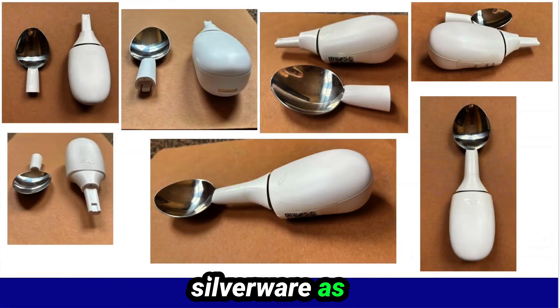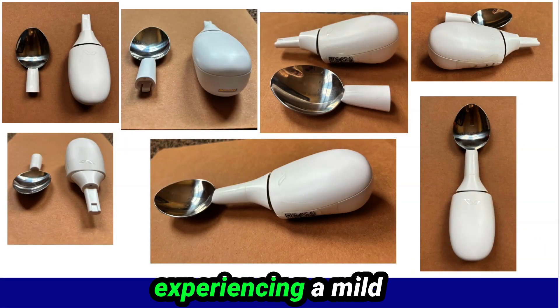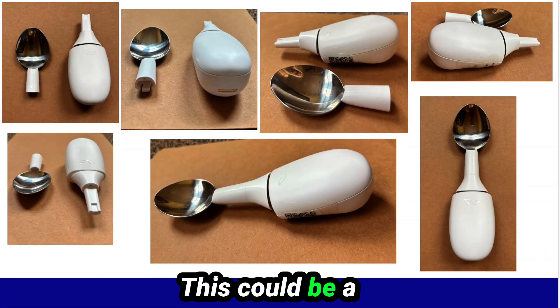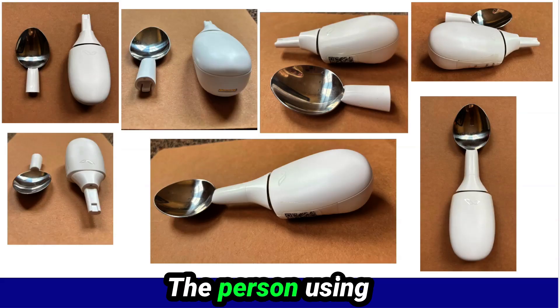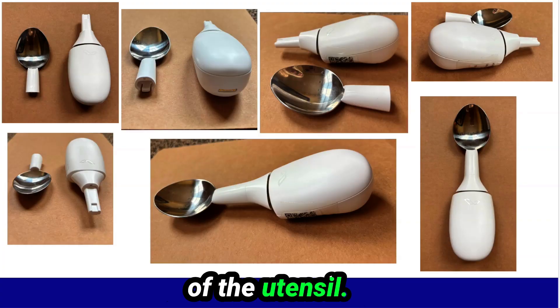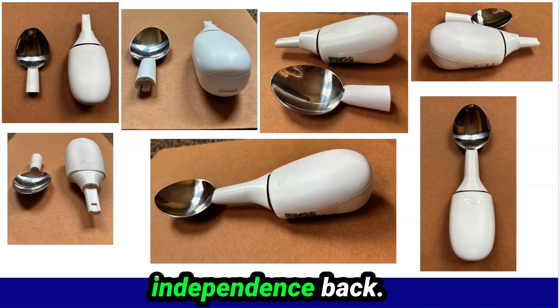Liftware Steady silverware is for people experiencing a mild to moderate tremor. This could be a tremor induced by Parkinson's, anxiety, or an essential tremor. The person using the silverware can experience up to 70% less shaking of the utensil. This silverware makes eating easier and gives people their independence back.